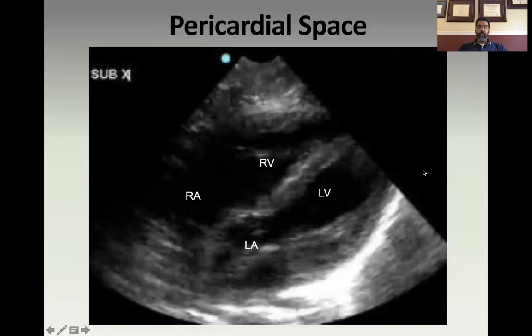And then here is your subcostal cardiac view. Again, this is in your abdominal setting. Notice the dot is on the screen left, and you're in your abdominal setting. So remember, the difference between your abdominal and cardiac settings is that you're not going to be able to accurately judge things like LV function in your abdominal setting. The only thing you're looking for here is fluid around the heart, pericardial effusion, which in the trauma patient would be assumed to be hemopericardium.